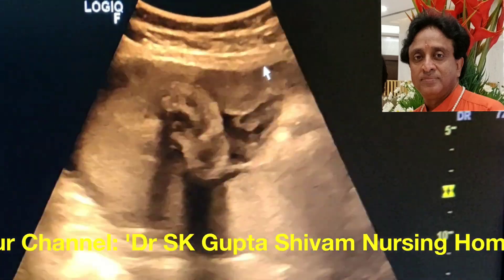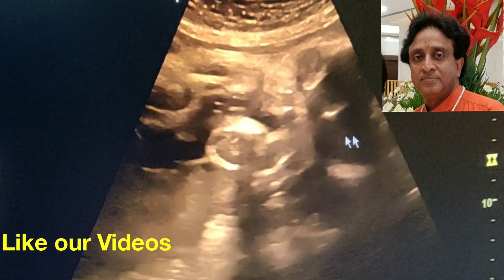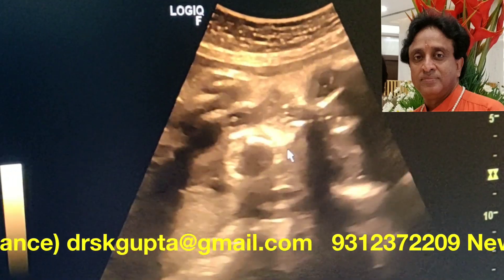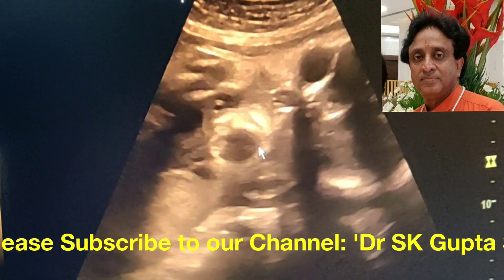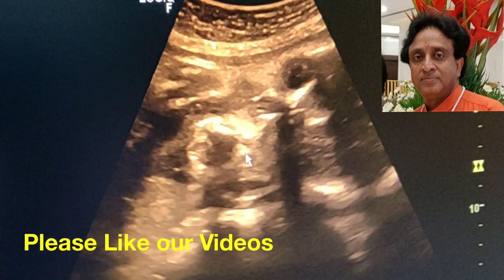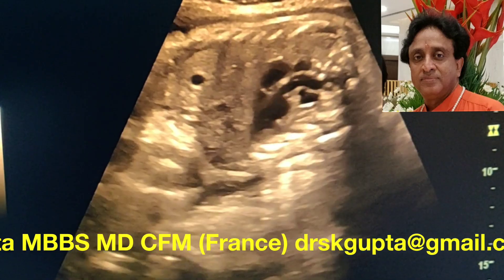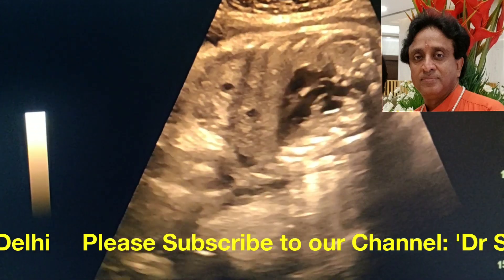We have to look for causes inside the fetus and we try to look for cleft lip. This is the head of the baby — you can see the orbits and the nose — but the acoustic window is very compromised because of the low amniotic fluid volume, so we are not able to comment clearly on whether the fetus has a cleft lip or not. It would be important to review any previous second trimester ultrasound for evidence of cleft lip, but no prior scan was available for this patient.